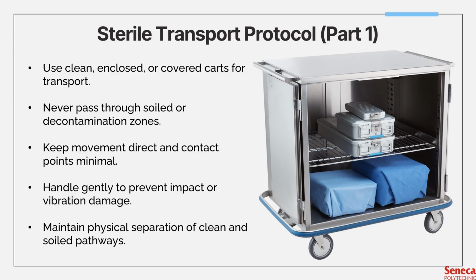Of course, there are some situations where, let's say, the closest route to the OR, an elevator, is out of service. You would have to take this up with your management and ask them what the best practice is to avoid longer routes, so that the case cart with the instruments is not contaminated as a result.